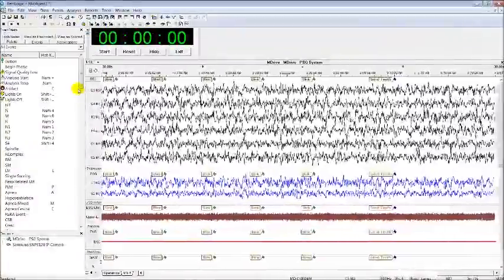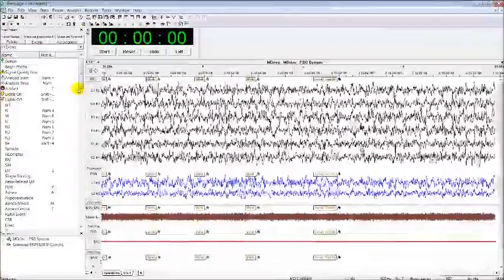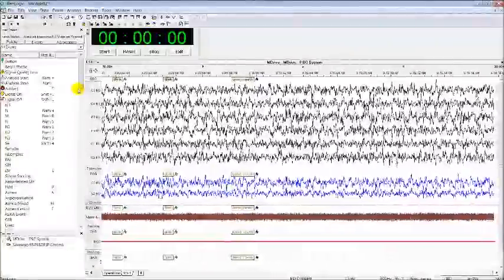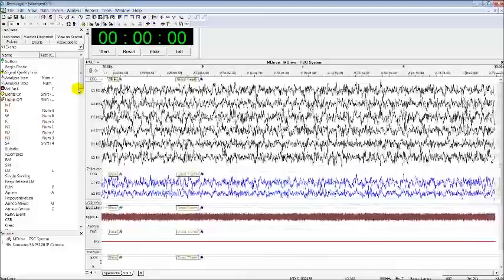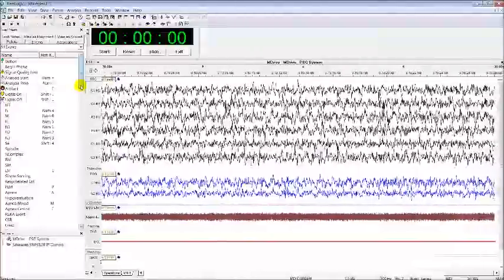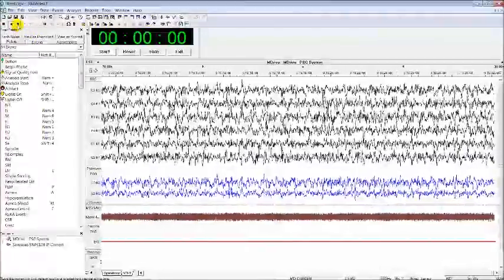Okay, and then this is the part that we will ask the patient to lie down quietly and try to fall asleep. And do remember that the instructions for the patient should be standardized for all the naps. Before we start the nap or we put lights off, this is the setting that I would like to do. First, I will change it to real-time interval.